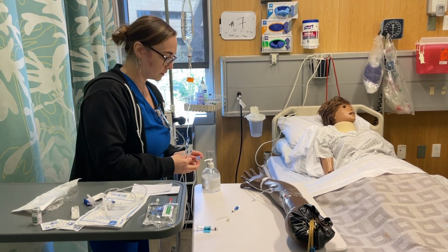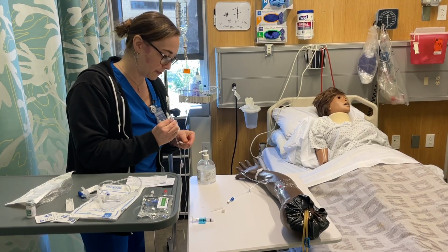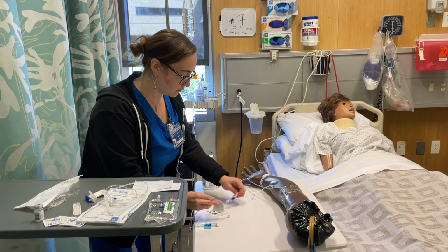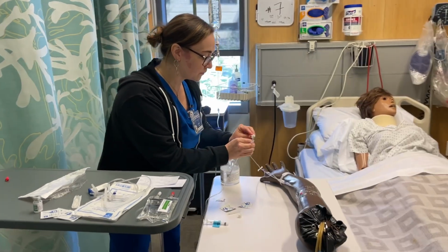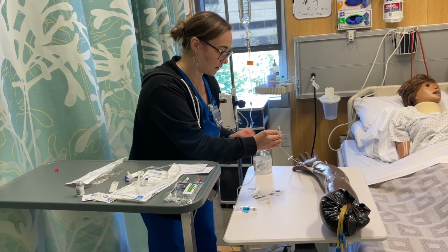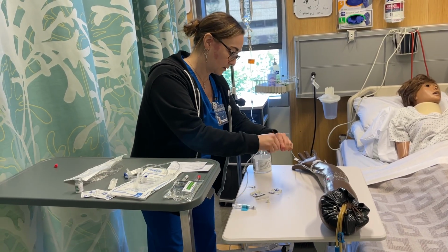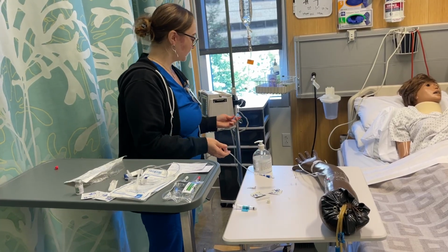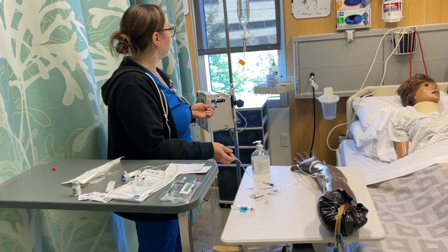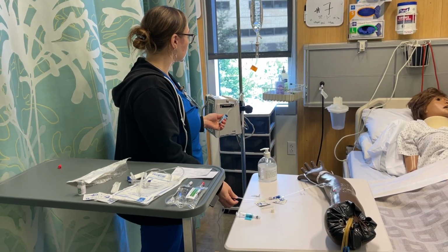I'm going to have an alcohol swab here, and I'm going to clean off the IV site. And this will be cleaned off for 30 seconds, and the outside as well. And then have that dry, and then I would attach the primary line. Okay. And then I'd have the primary line going, and that's going to be at a drip rate of 5 drips for 15 seconds.